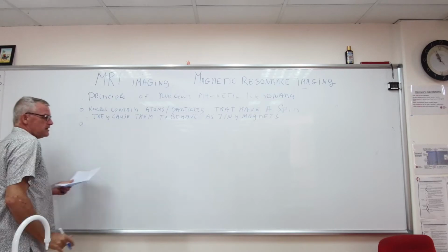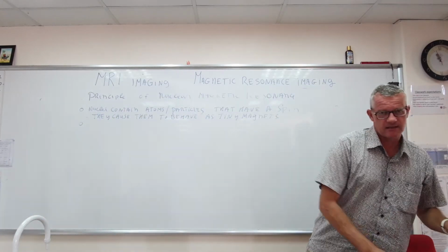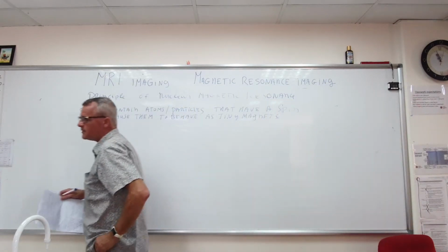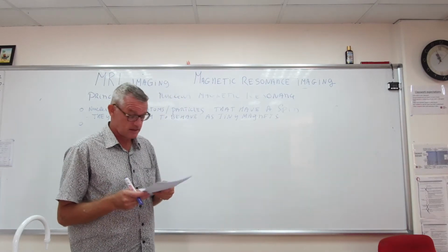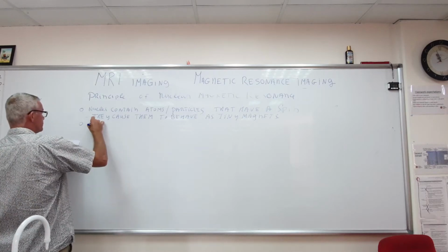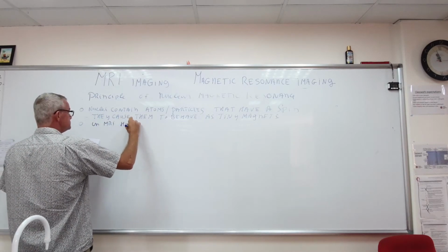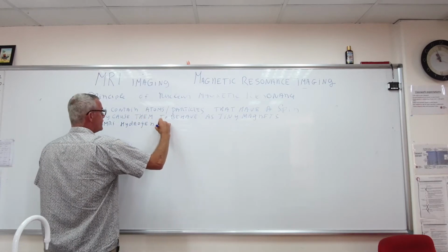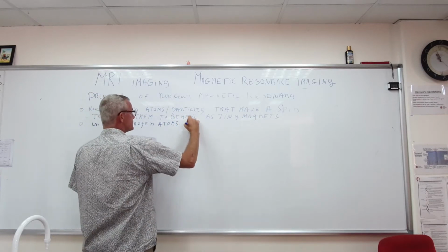Well, in the MRI specifically, we are studying the hydrogen atoms simply because hydrogen atoms are everywhere present in the tissues. Yeah? And what do we know about hydrogen atoms?